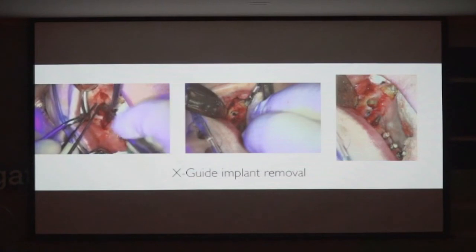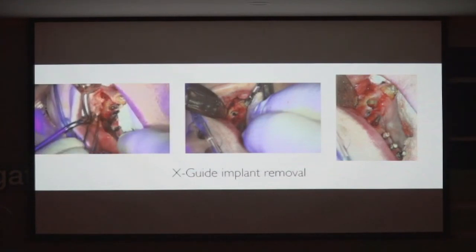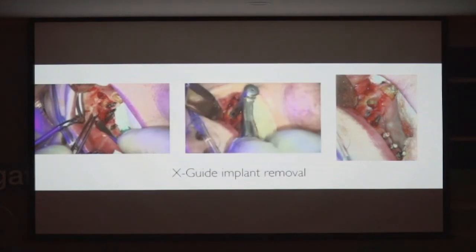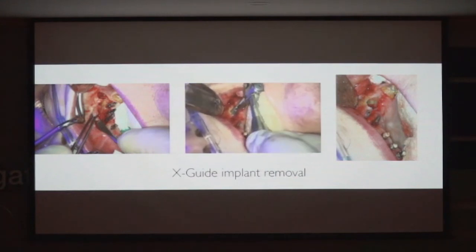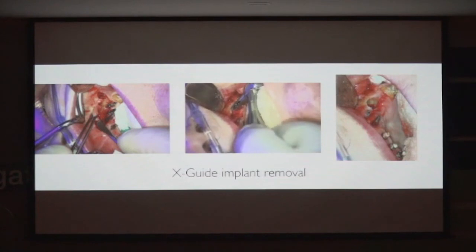I'm going to be taking out all these implants and releasing the flap, doing a little bit of stretch in there. And now what am I doing? I'm doing system checks because I'm using a trephine to take the implants out. I'm removing the implants from the guidance, and I don't want to drill with that trephine up into the nose.